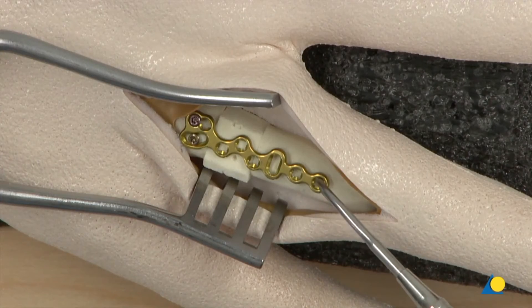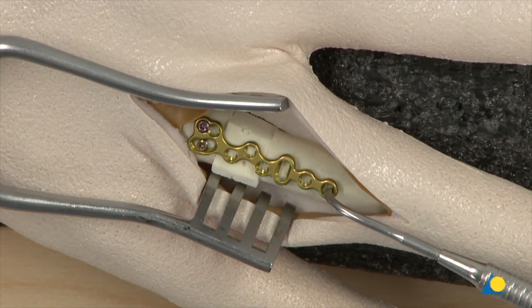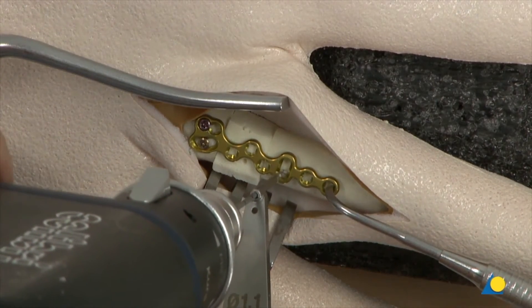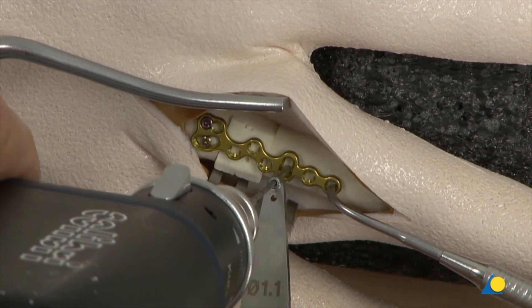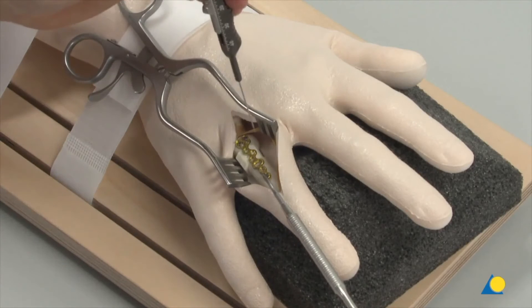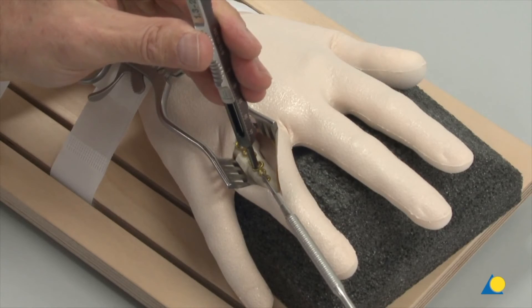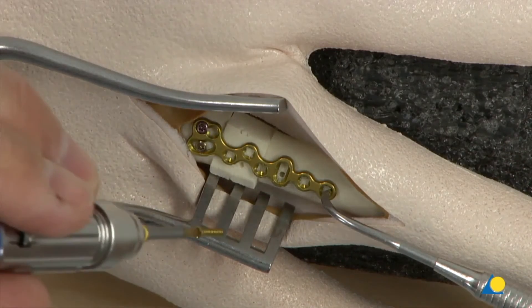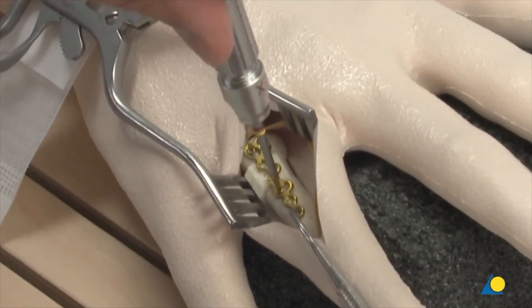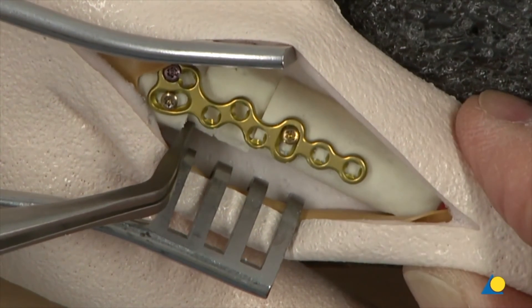In order to compress the bone fragments and the bone graft, a sharp hook is inserted into the most distal plate hole and pulled distally. The conventional cortex screw is inserted through the longitudinal hole of the plate shaft using the 1.1 double drill sleeve and 1.1 mm drill bit. The screw is not fully tightened in order to allow final adjustment of the distal shaft fragment.